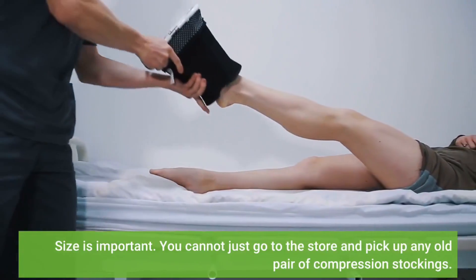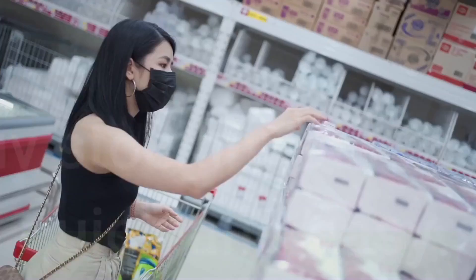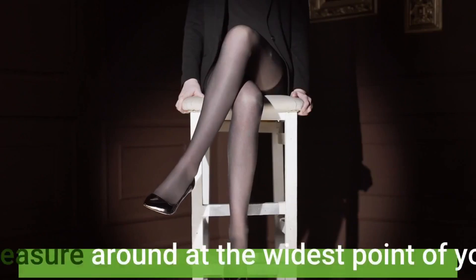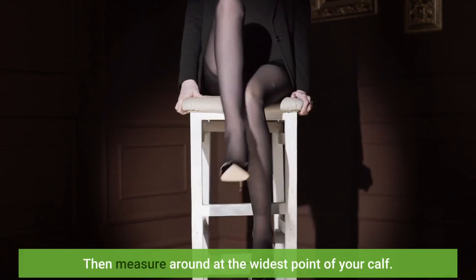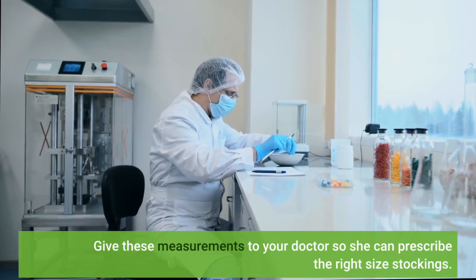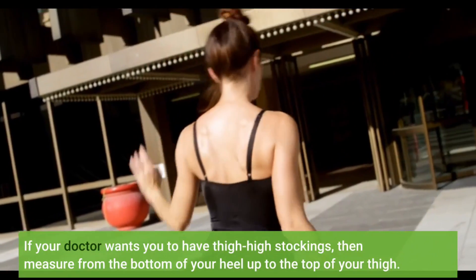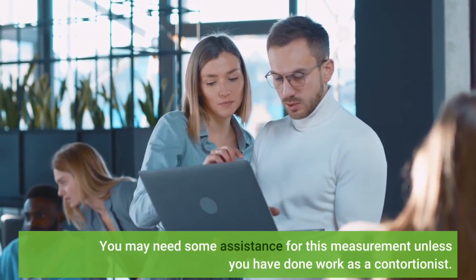Size is important. You cannot just go to the store and pick up any old pair of compression stockings. Measurements have to be taken to ensure you do not buy stockings that are too tight. Measuring is quick and easy — measure around at the widest point of your calf. Give these measurements to your doctor so she can prescribe the right size stockings. If your doctor wants you to have thigh-high stockings, then measure from the bottom of your heel up to the top of your thigh. You may need some assistance for this measurement unless you have done work as a contortionist.